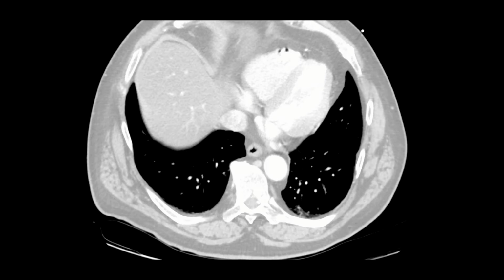Anyway, hopefully you're checking your images and you may have noticed, look at all this air in the right ventricle. Well, now what do you do? I mean, do you just freak out and call a code?